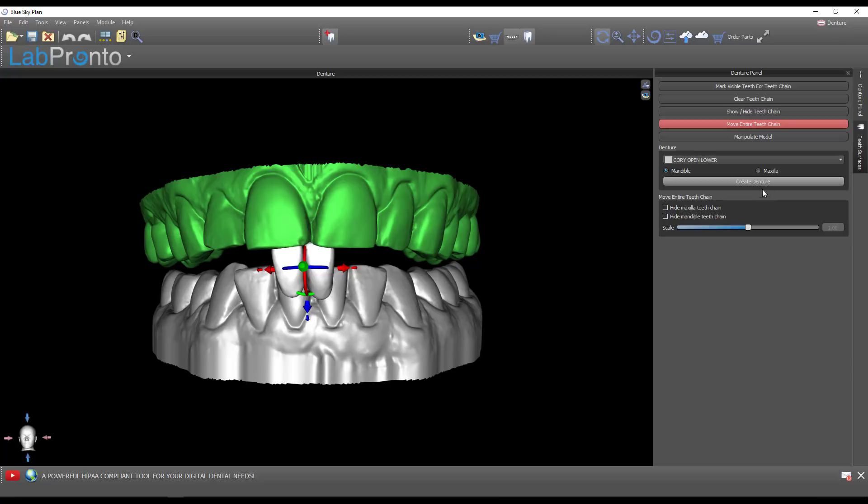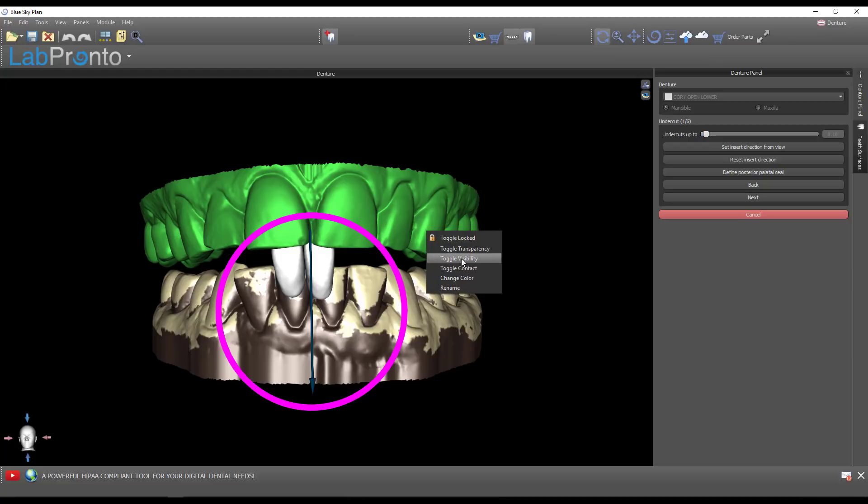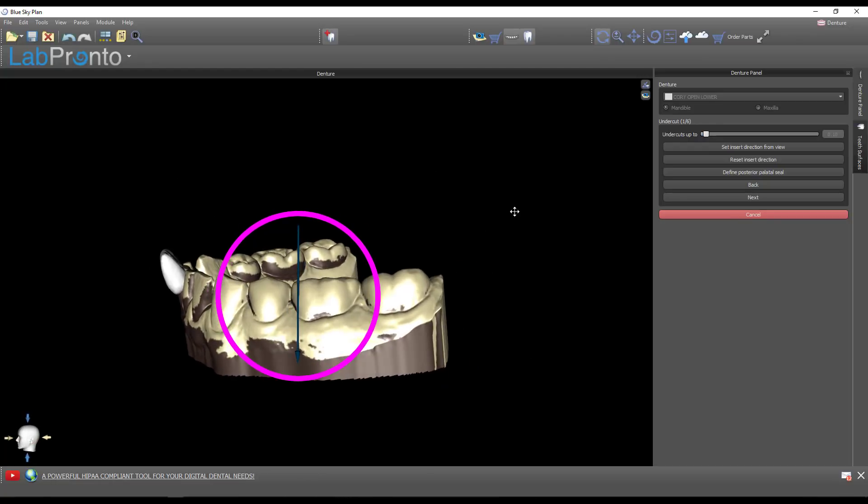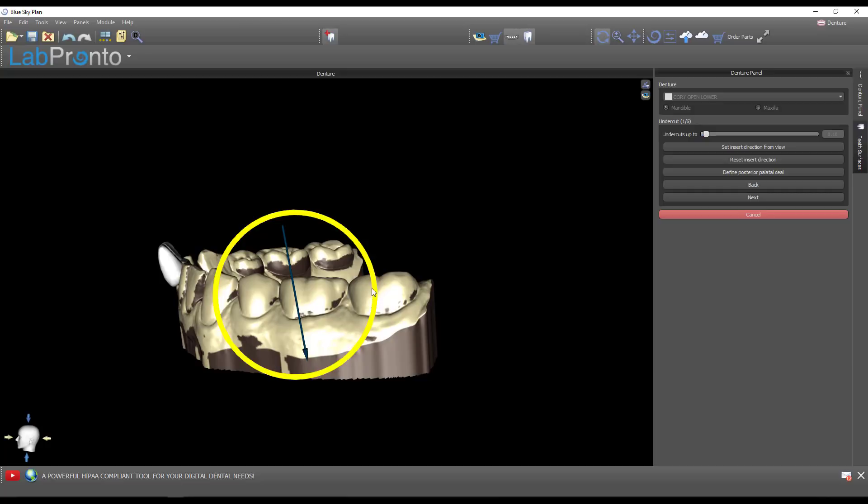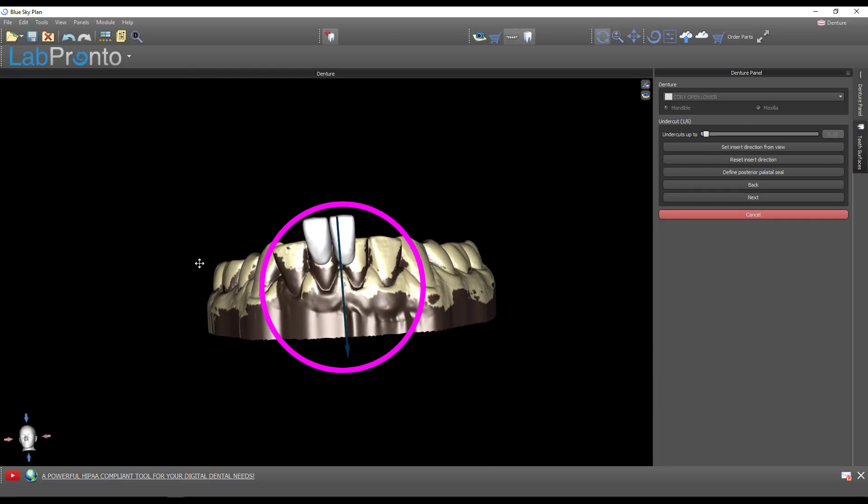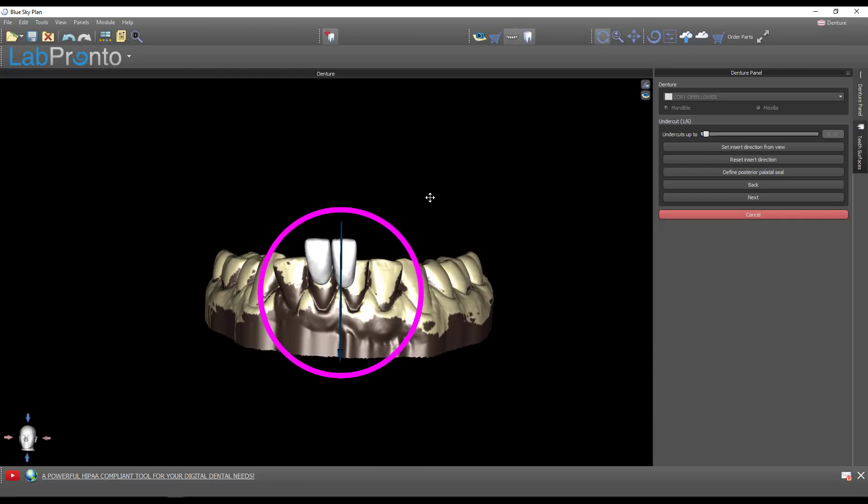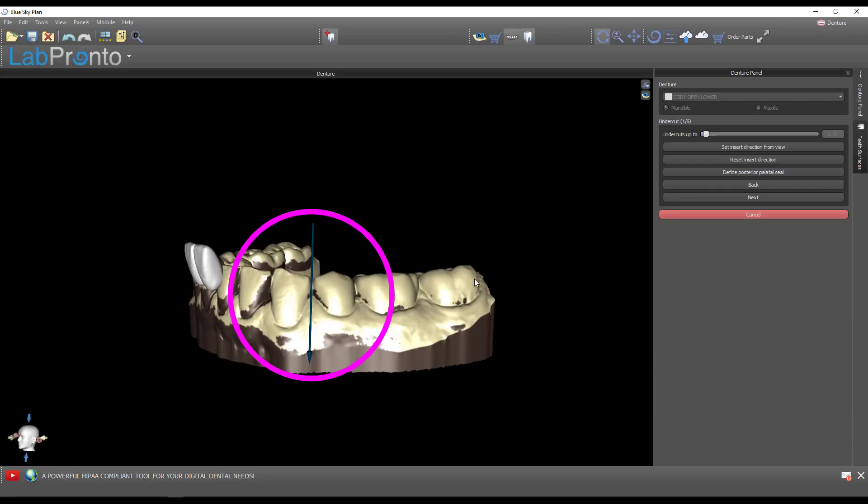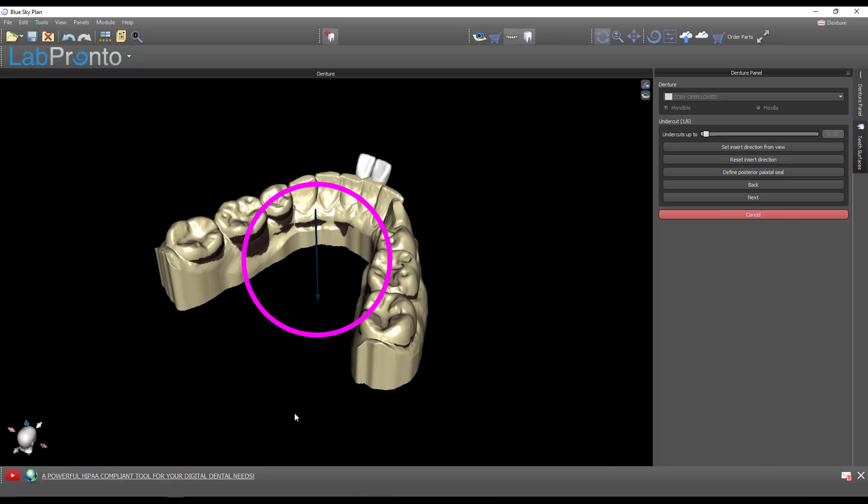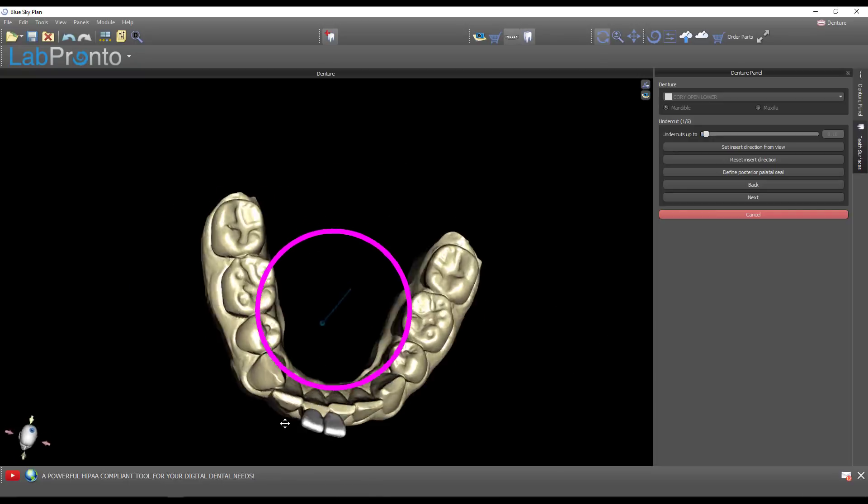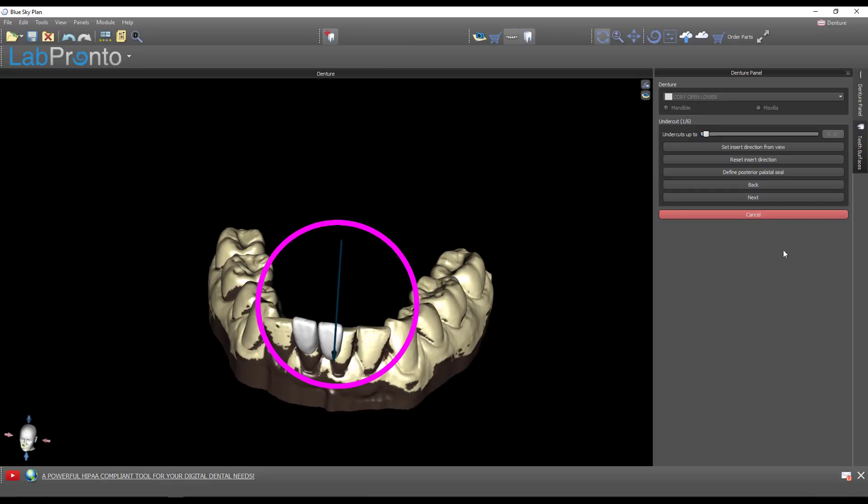Now go to the denture module and select which model we're building on - the lower model, choose mandible, and push create denture. I'm going to hide the maxillary model. This step is asking you to identify the path of insertion. The brown is all undercut. I want to figure out the best reasonable axis of insertion that minimizes undercuts, realizing I'm not going to carry my guard beyond the height of contour on the buccal.